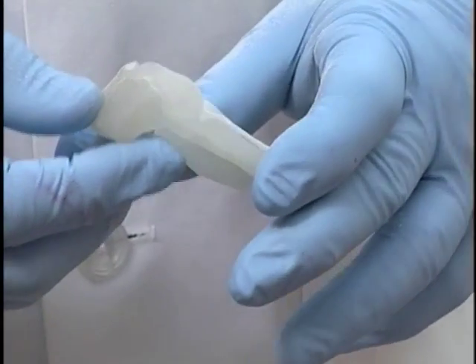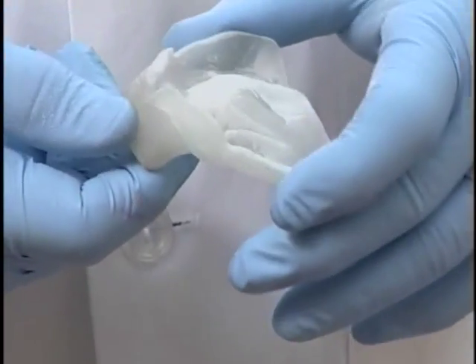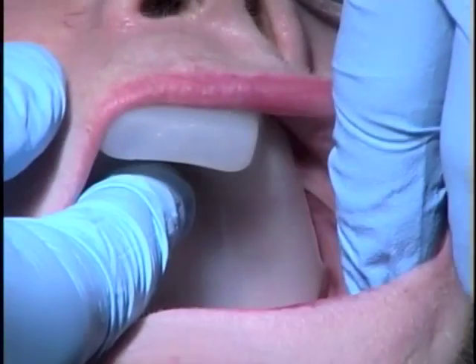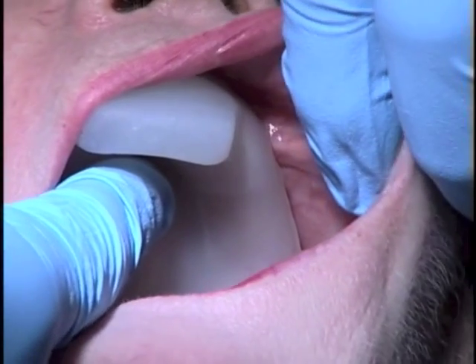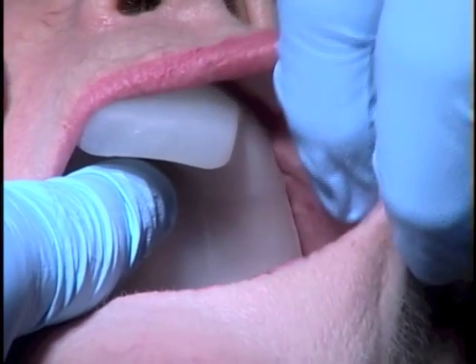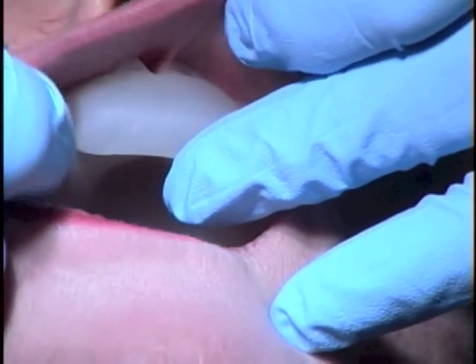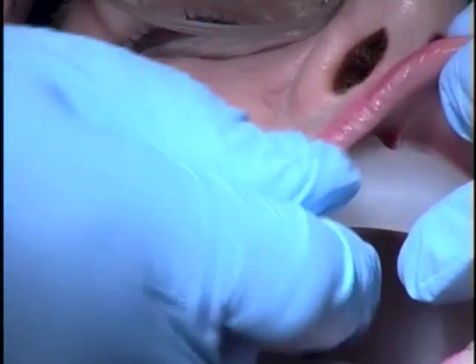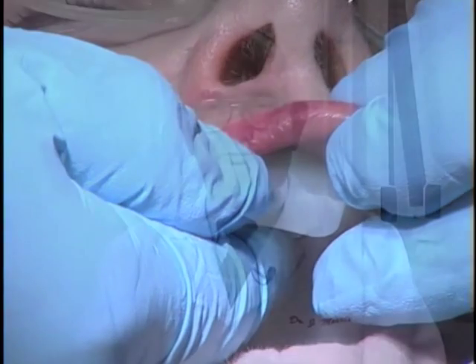And now that we have them trimmed, we will wash all the debris off of it and try it back in the mouth to see that we have it at the proper extensions. Now that we have trimmed the tray, we can see that we've developed a 2 to 3 millimeter space between the edge of the tray and the peripheral roll of the tissue. And let's observe the labial, and we have the same thing. We have produced a 2 to 3 millimeter space, which is adequate for our border molding.